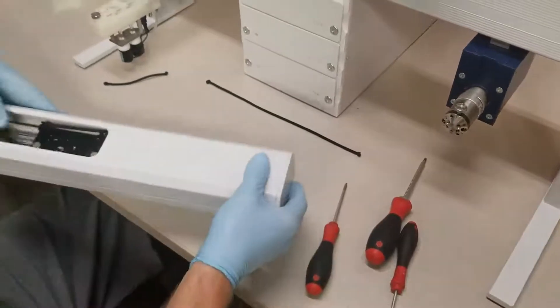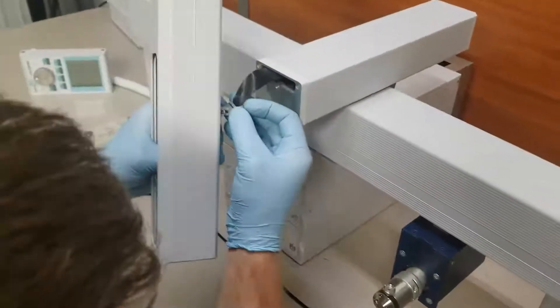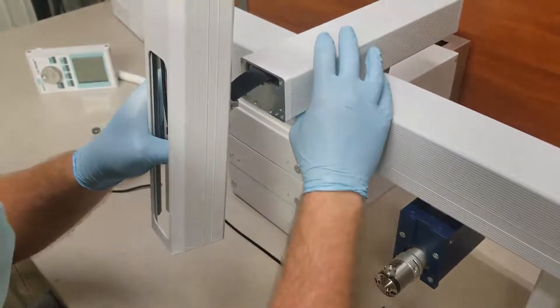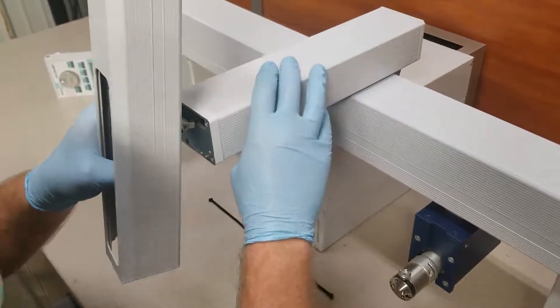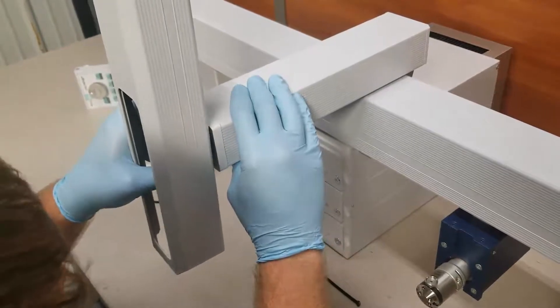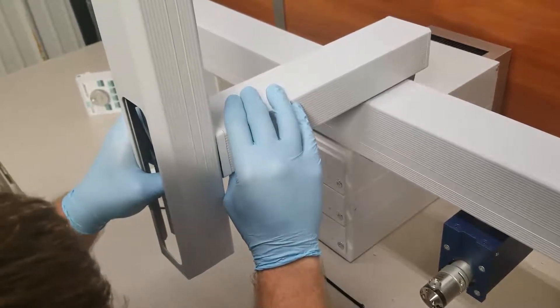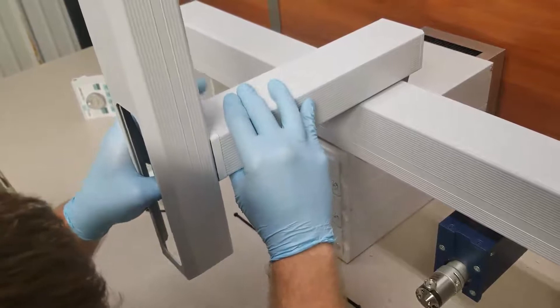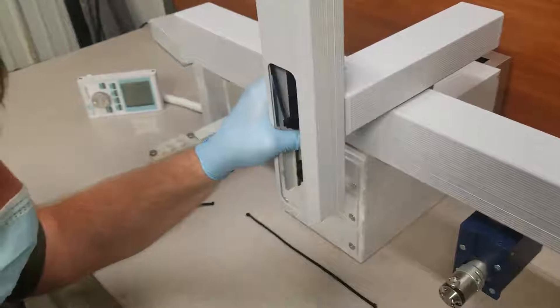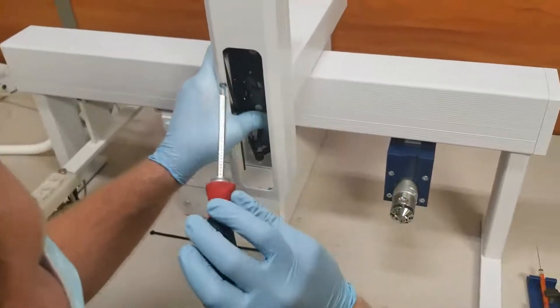The injection head is now ready to be reconnected to the rest of the instrument. To do this, you'll want to connect the flat cable snugly and firmly in place. A very important step now is to first feed the Y axis as far out as it will go, and then reattach and line up the injection head on the two guide pins. Once that is in place, we'll reattach using a Torx 20 driver and reinstall the three screws.